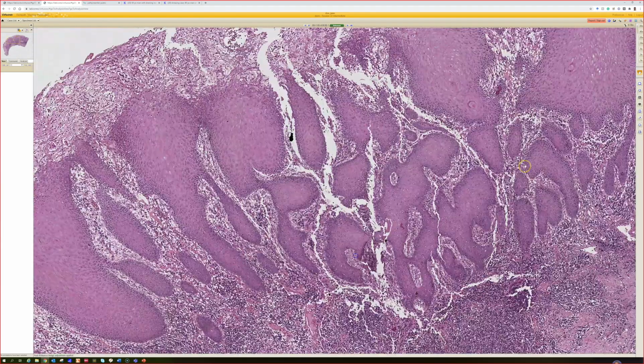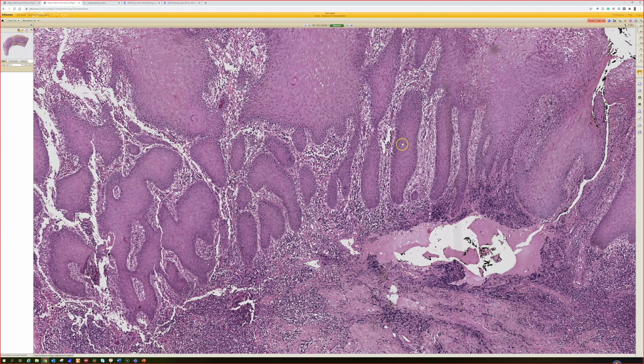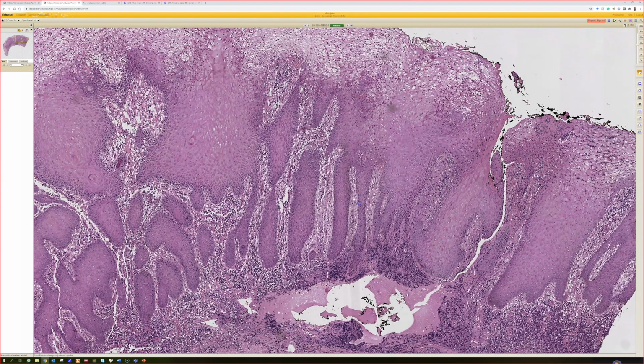Yeah, this is definitely syphilis, but you're right. Without the stain, you wouldn't be able to make it for sure. But this is a really nice example of condyloma lata, which of course is a form of kind of warty overgrowth of epidermis that I think is still considered secondary syphilis. My understanding of the way it's thought of is kind of an unusual variation of secondary syphilis. I've only seen these rarely in practice.